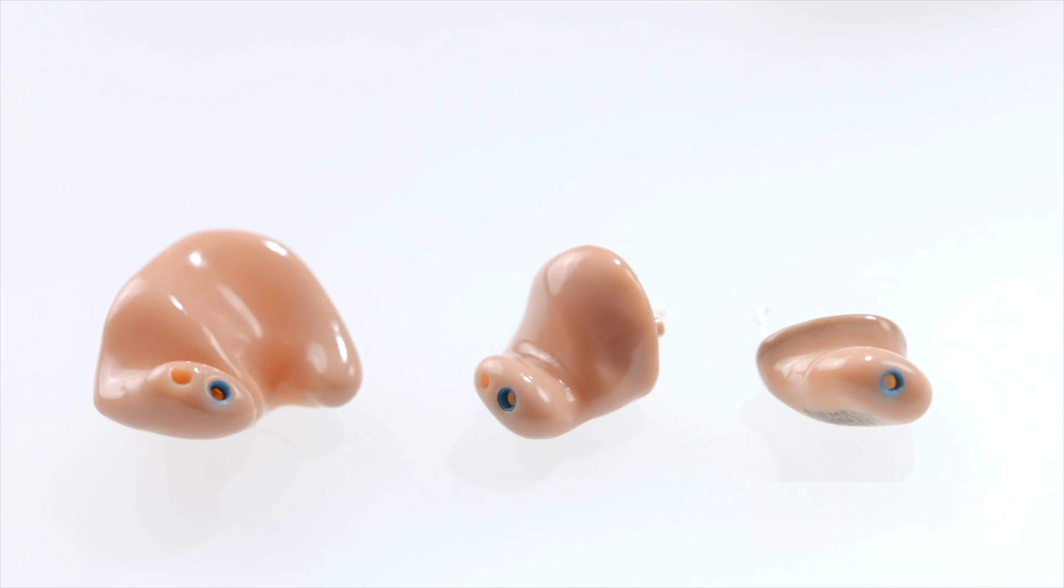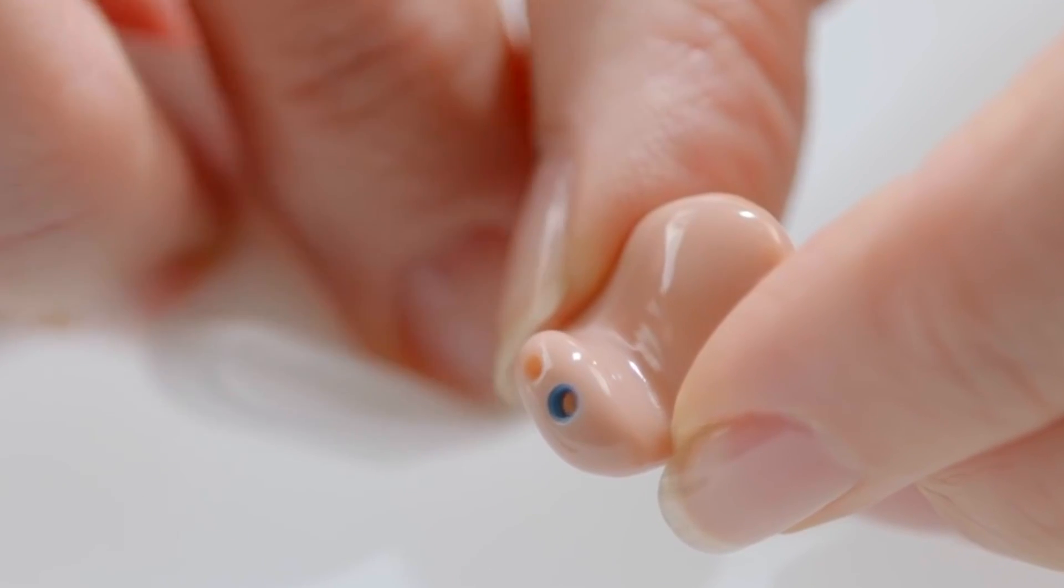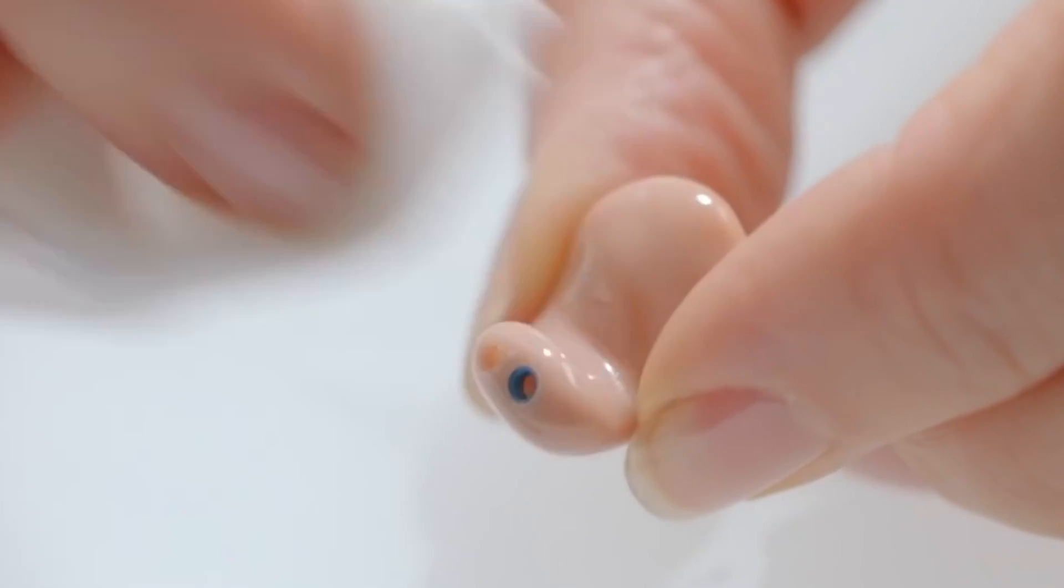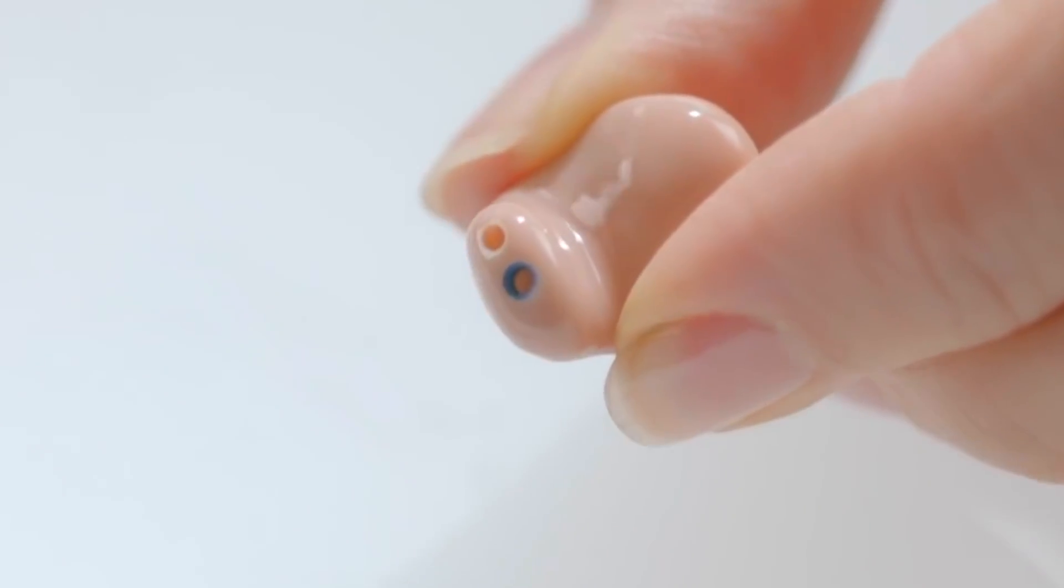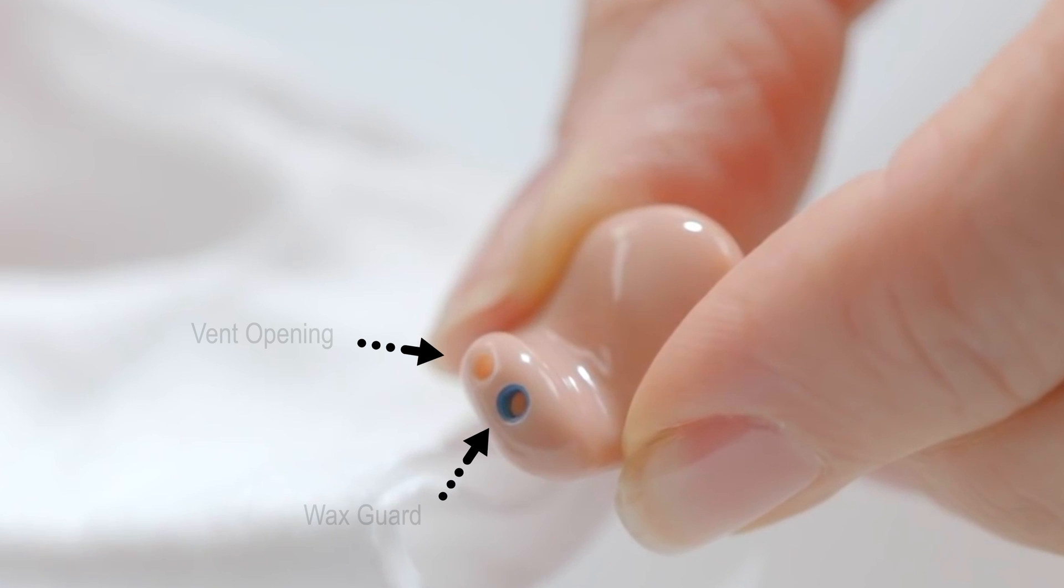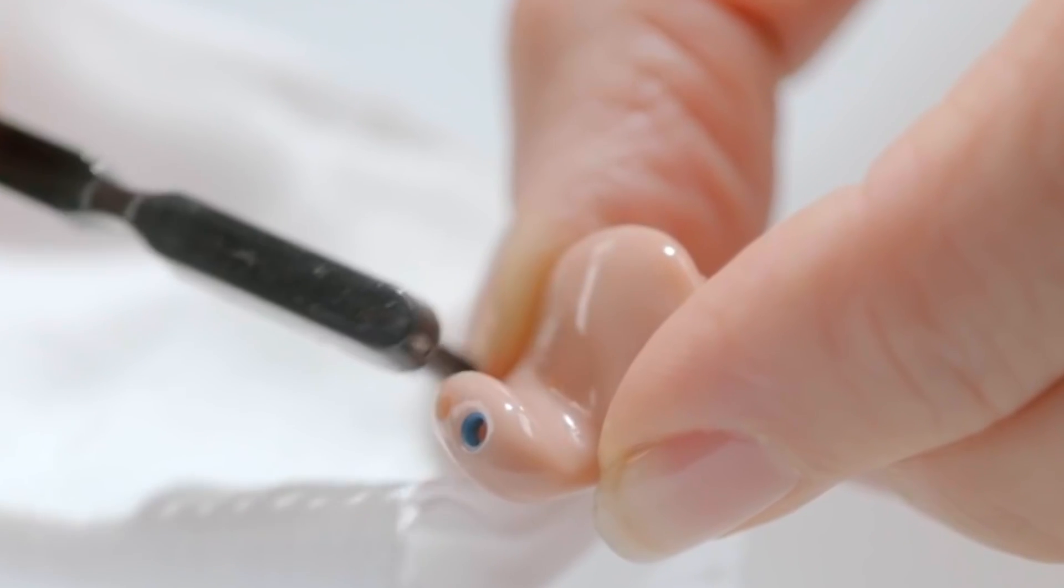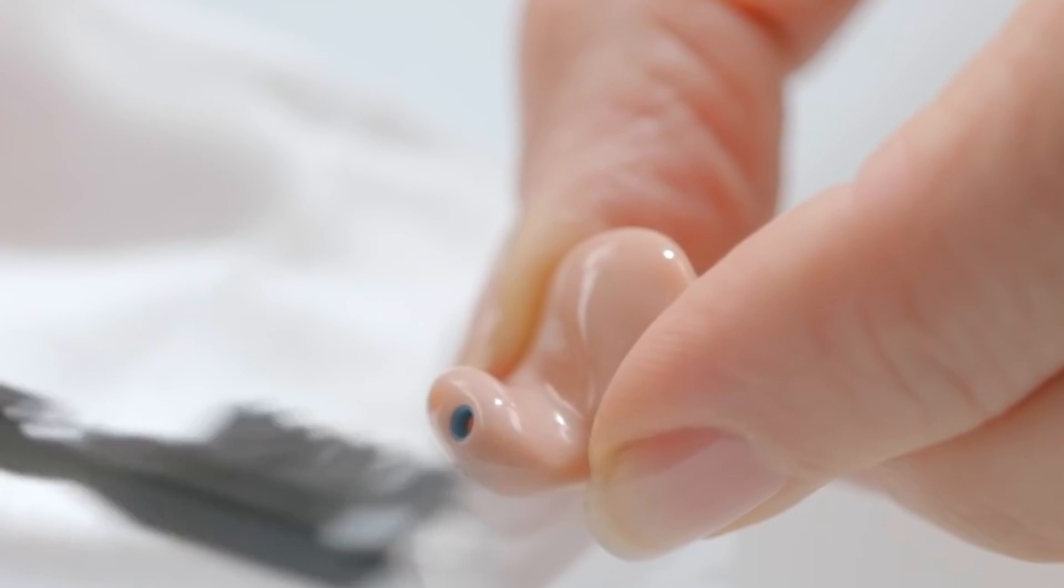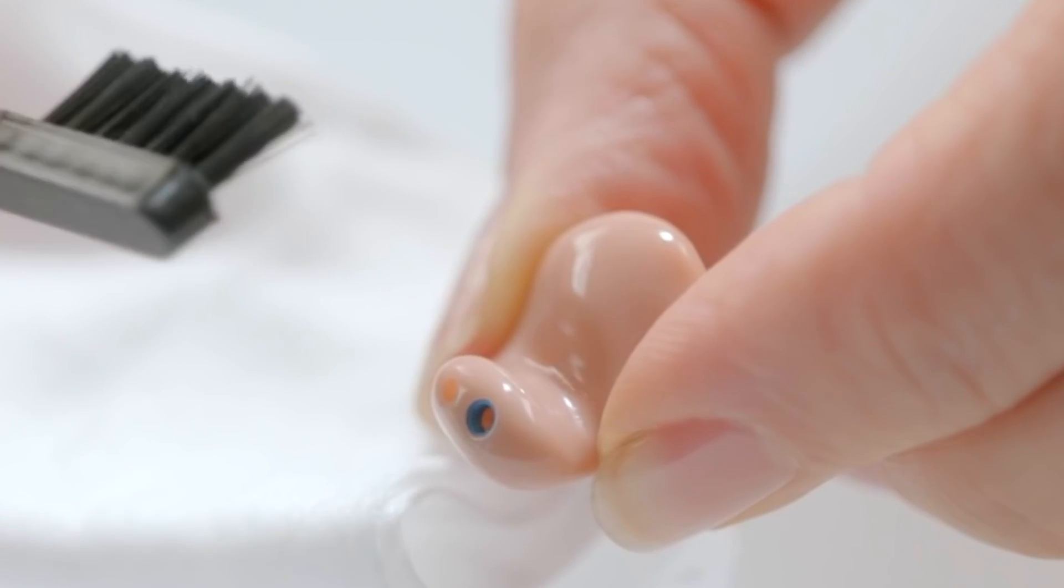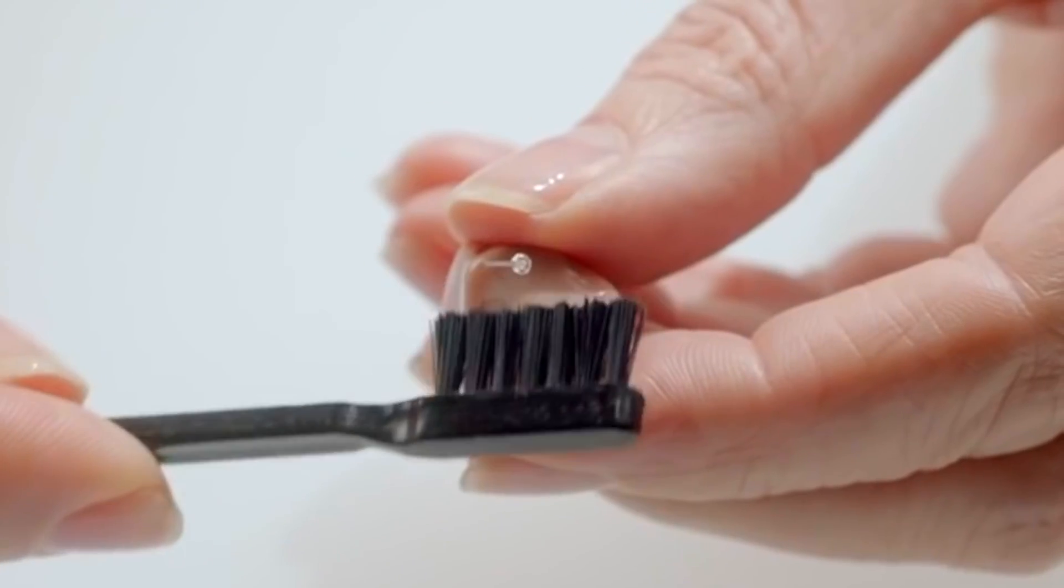For custom in-the-ear hearing aids, cleaning is similarly performed as for the behind-the-ear hearing aids. Wipe the outer casing with a dry microfiber cloth. More stubborn spots can be wiped away with a damp cloth. A brush can be used for particularly stubborn areas. Remove any earwax that may be blocking the microphone and vent openings with the brush as well.